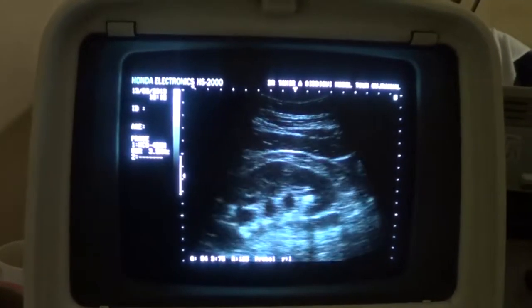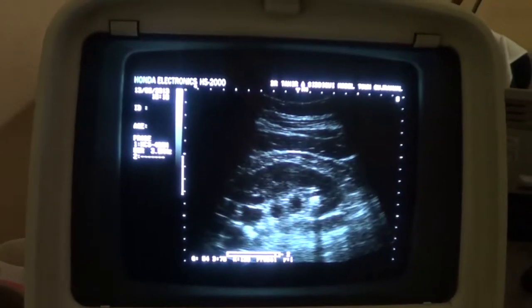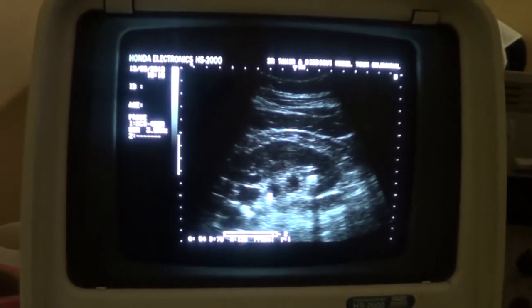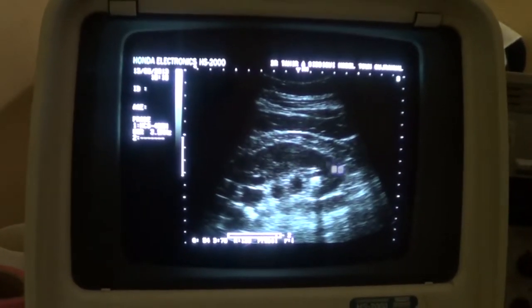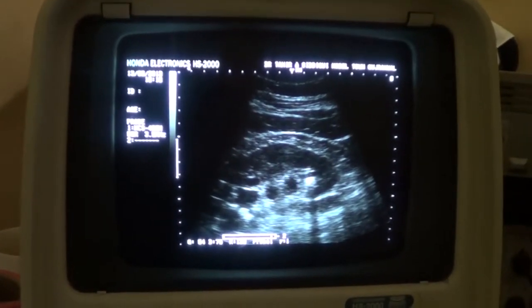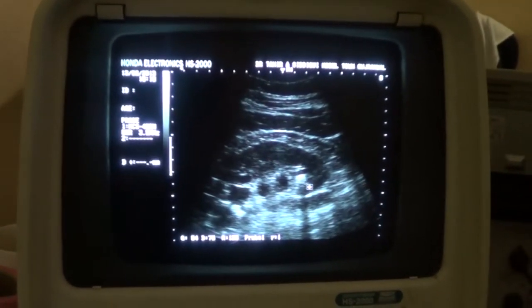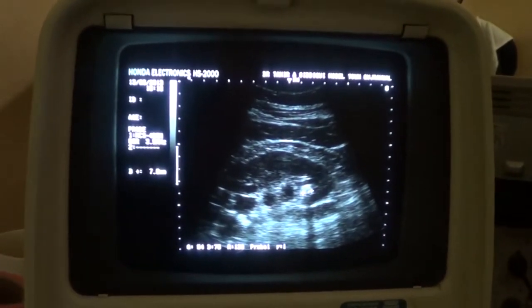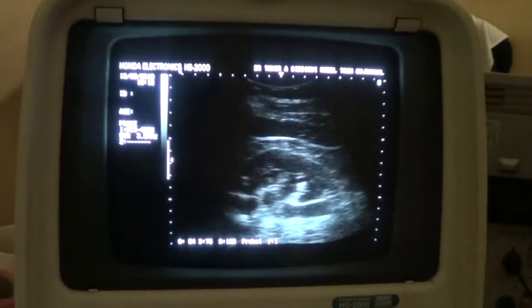There is another calculus seen at the lower pole. This is the mid region of the left kidney, and this is the lower pole. Here we see a calculus within the dilated calyces, giving sharp posterior shadowing because it is more calcified. This measures 7.6 millimeters. So there are two calculi within the dilated calyceal system.